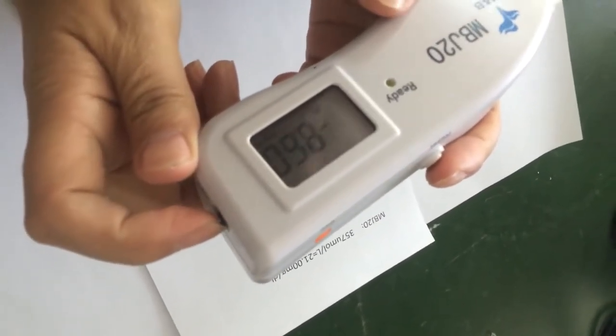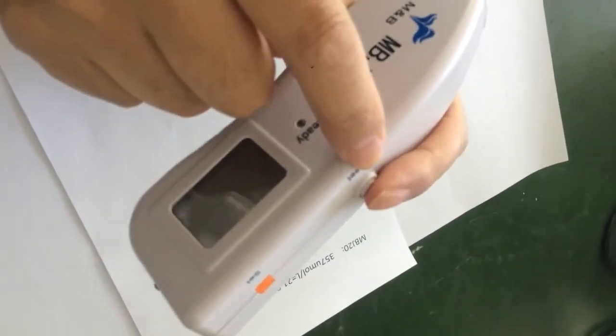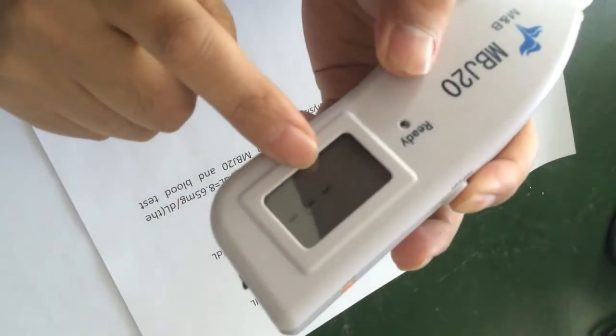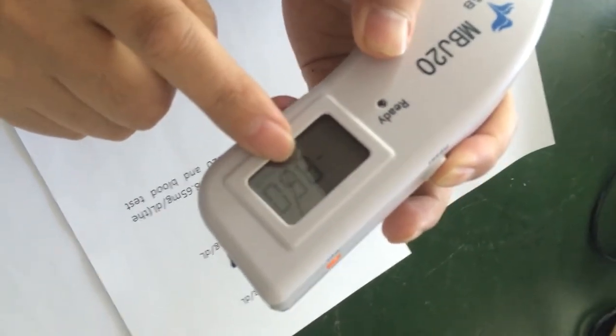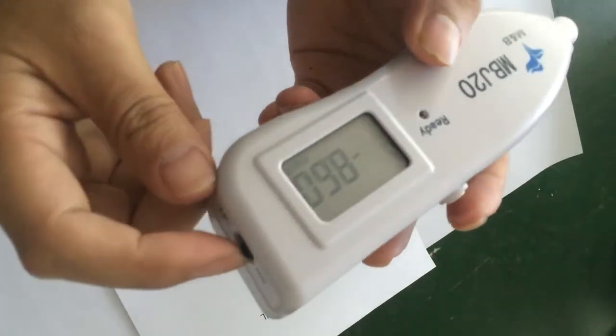Let's check it. Turn off and press this button, and at the same time switch on, and wait until the number appears. We can get the number — that's right, this is the right number. We can confirm it is reduced. No problem.